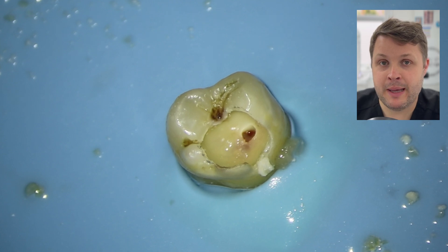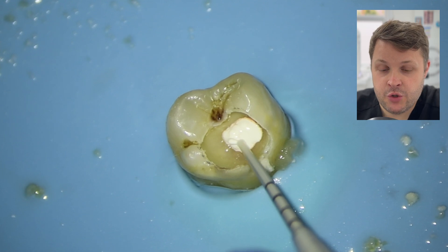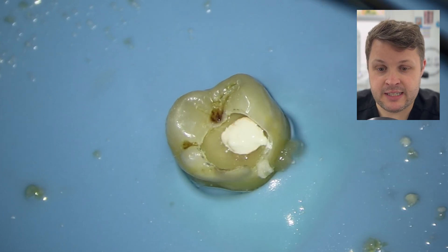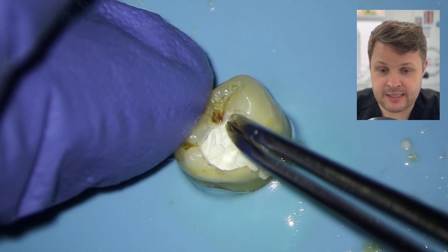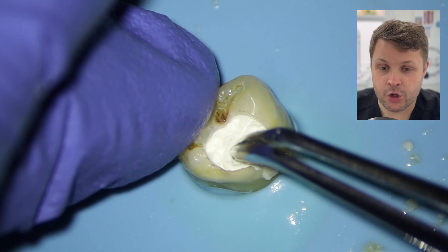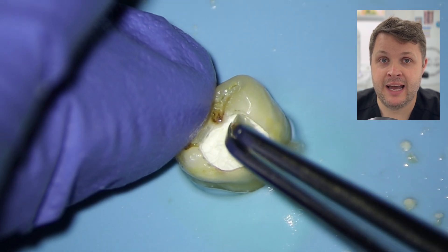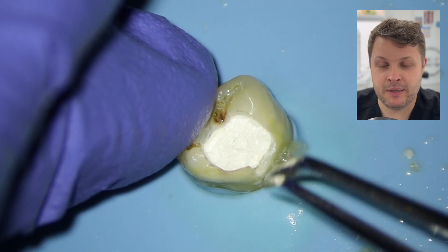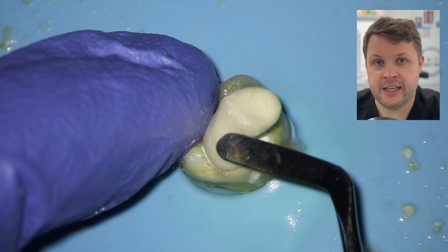What's probably a better option in this case is not to aggravate the tooth too much and just put a dressing on top. I'm going to dress the tooth with a non-setting calcium hydroxide — I personally think that's the best dressing material. You get your ledermix and you get your Odontopaste and things, but in this case I'm going to use a non-setting calcium hydroxide. Then I'm going to pack the tooth with some PTFE tape. This is better than a cotton wool pledget because once you put the GIC on top, it's not going to get kind of enmeshed in the cotton wool. Although I have mentioned on a few videos previously that I will use cotton wool on occasion, especially because with cotton wool you can soak it in the intracanal medicament and place that on top — sometimes in certain clinical cases, that can be helpful. But obviously trying to remove that temporary filling can be a bit difficult, and using PTFE is quite clean. You're going to push the PTFE into place and then you're going to place a GIC on top.